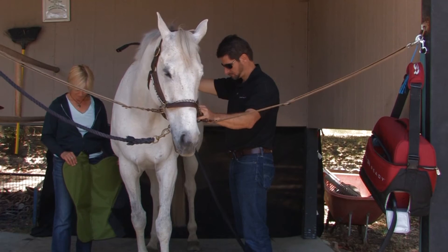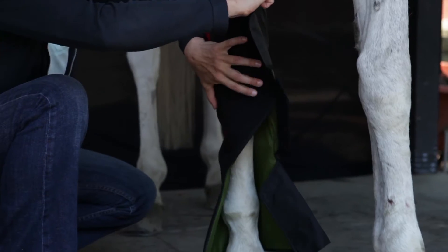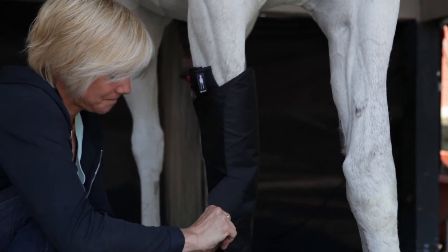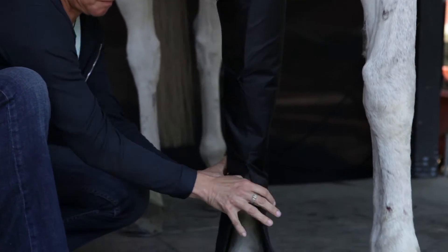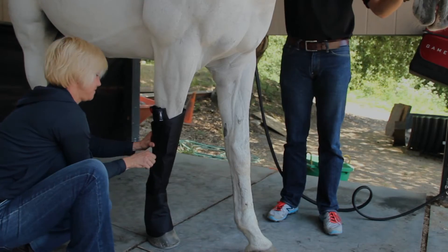To apply the Equine Full Leg Wrap, place the wrap around the horse's leg, aligning the hose connection on the outside of the leg. Hold the wrap behind the knee and secure the hook and loop flaps on the side of the leg so that the wrap fits snugly.